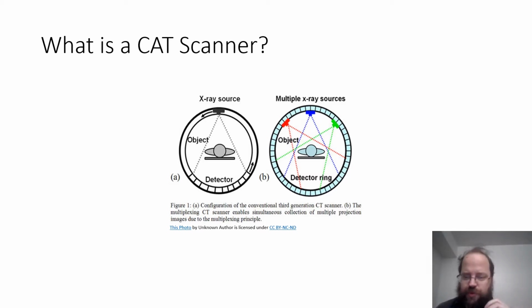The computer knows which ones it's from, and by extracting certain images from specific beams, the computer can even slice up the patient in much smaller slices, and they can even do movement. They're fast enough now that they can look at the heart while it beats and capture it between beats, like make a small film and see its performance. But for the brain, we're more interested in a static image. We may want to look to see if there's pulsations in blood vessels and things, and that's where using contrast dye of iodine comes in. We'll get to that later.